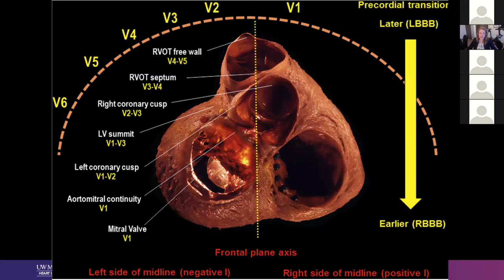And I find this to be really important, and something that as electrophysiologists, we often have to get our hands dirty. So I'll go into the pre-procedural area and I'll see that someone's getting an EKG and V1 and V2 are in the mid-clavicular line for some reason in that patient, completely wide-spaced. Or V1 and V2 more commonly are placed too high, let's say in the second intercostal space and not the fourth intercostal space. This can also happen in your lab. Most of us have travelers coming in and out, and most of us make mistakes, it turns out, and that's true of your lab staff as well.